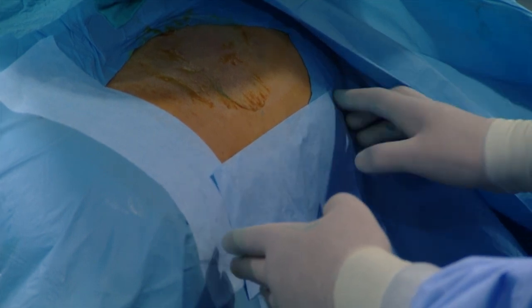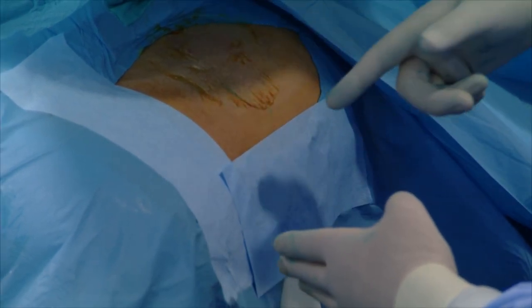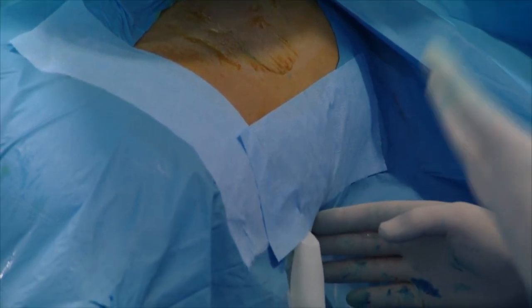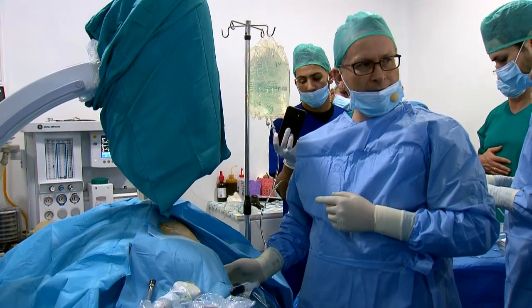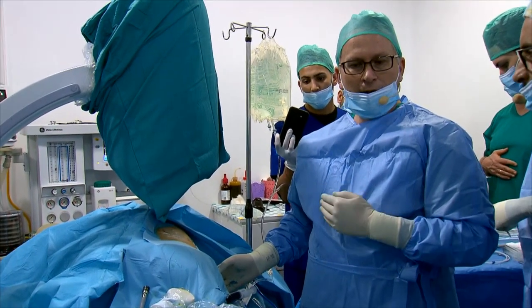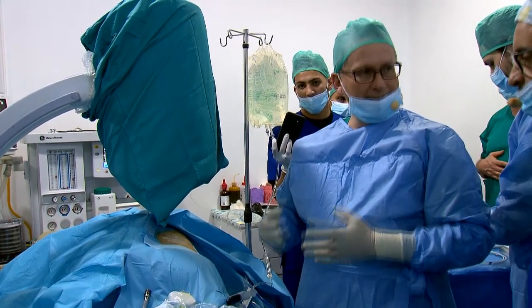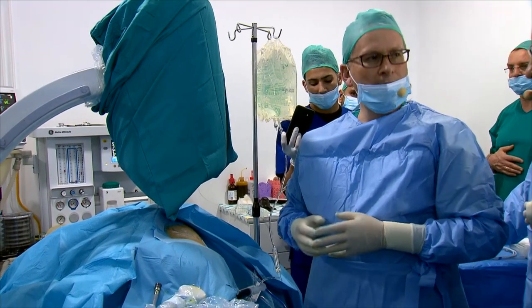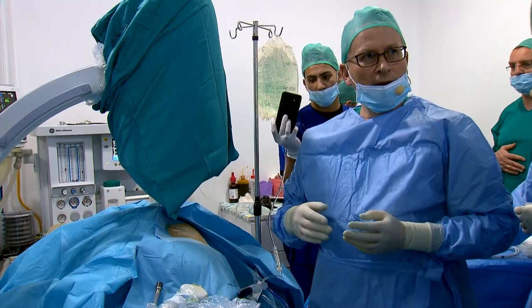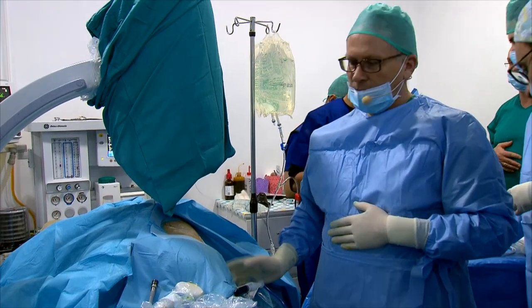This is like Dr. Sanjay from Nepal does. He has two cushions, a mobile kidney, and this is the reason why he always punctures the mid-calyx. I prefer to have a fixed kidney with only one cushion and to have a good ultrasound access to the kidney, and I always puncture the lower calyx. From my point of view, puncturing the lower calyx is more secure than puncturing the mid-calyx. But we all know that both approaches to the kidney lead to a comparable success. It only depends on your personal experience, which means there is no better method. All methods are equal, but you should always remember what is the difference in positioning the patient.